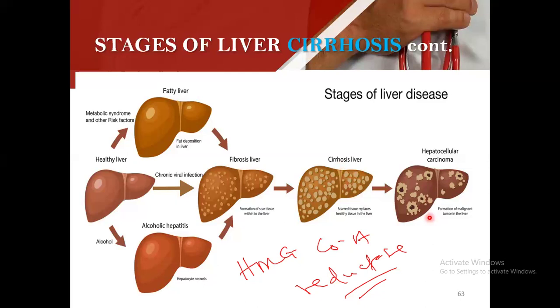When fat is deposited excessively in the liver, we call that fatty liver disease, and that is hepatic steatosis.